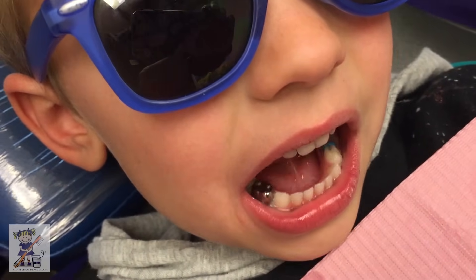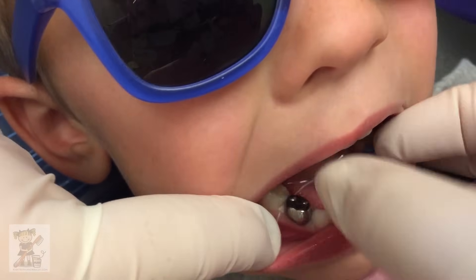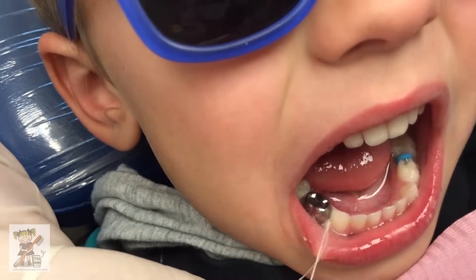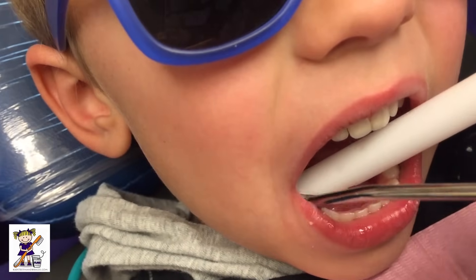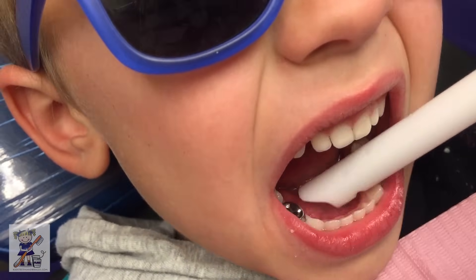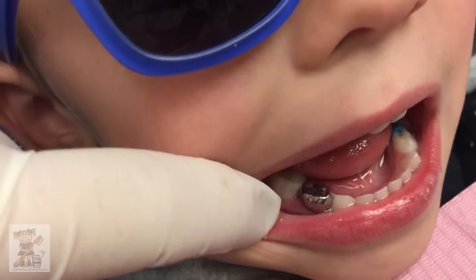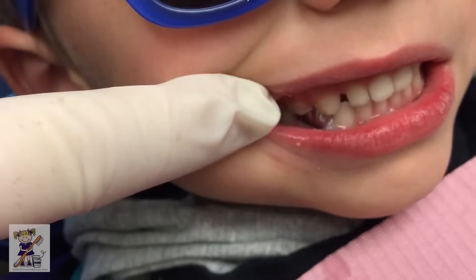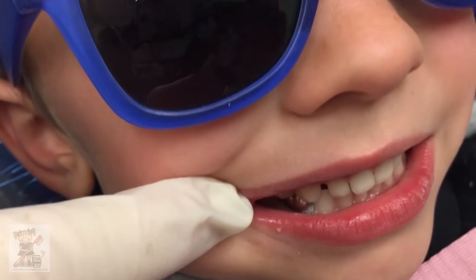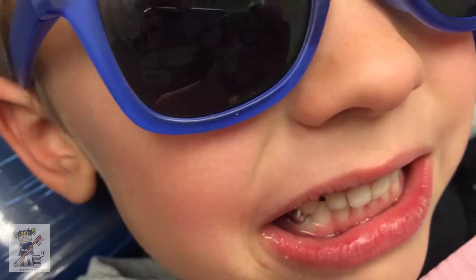So it takes two and a half minutes for the glass to set, and they'll feel that tightness. You'll see the tissue blanch a little bit, but that's all it is. Easy peasy. Now we're just going to rinse and floss away the extra cement and you're done. This bite actually looks fantastic, but it does self-adjust within a week or two by supereruption of the adjacent teeth and a little bit of intrusion of the tooth that has the crown.